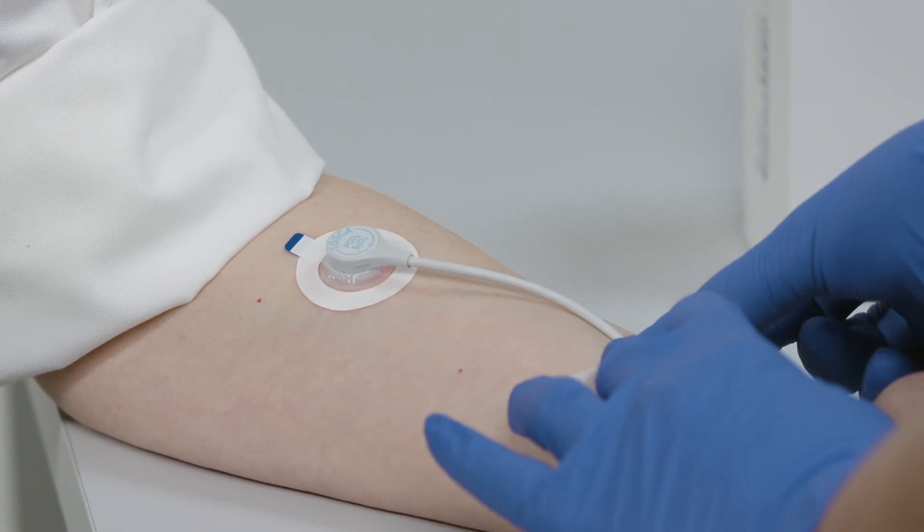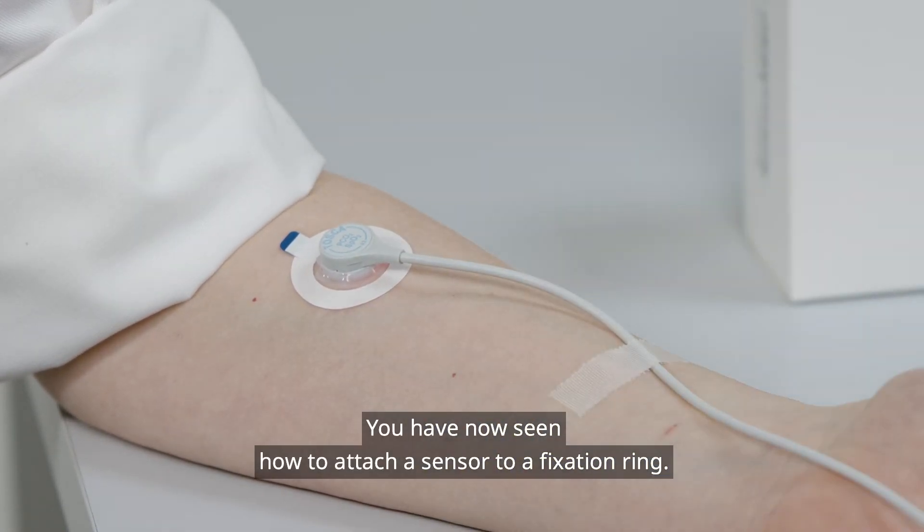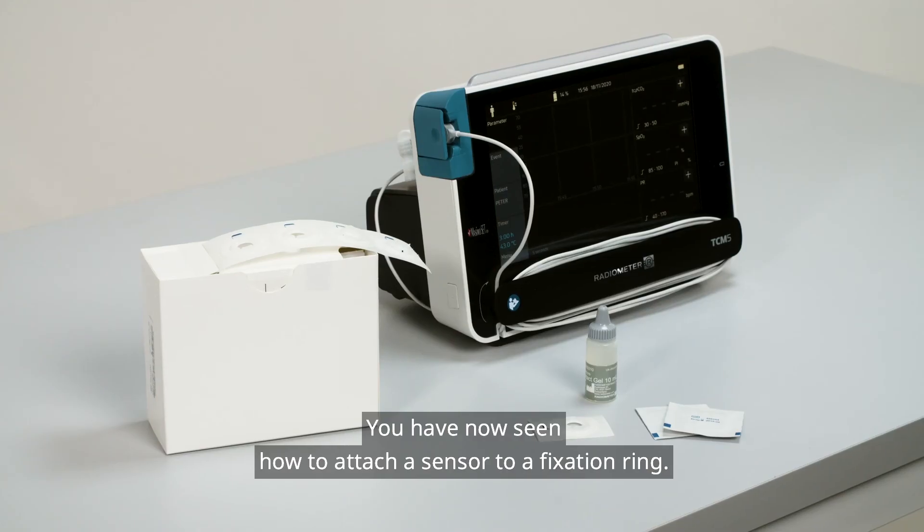You have now seen how to attach a sensor to a fixation ring.